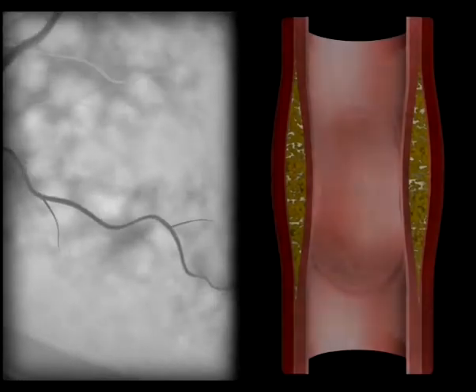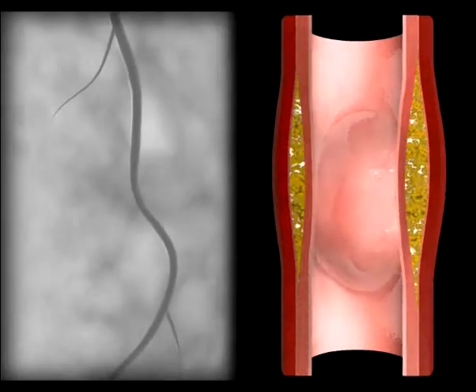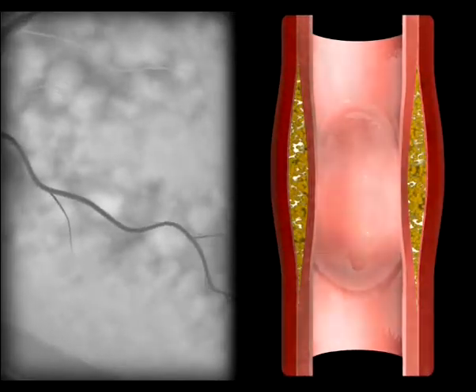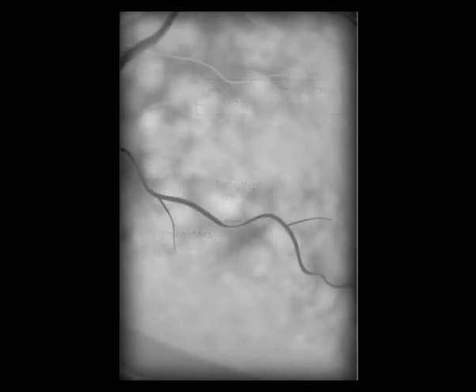tissue itself. This is because angiography provides only a 2D projection of the lumen and offers no information about the disease present inside the vessel wall. It is important to note that angiography only highlights where blood is flowing and thus where the lumen has narrowed.